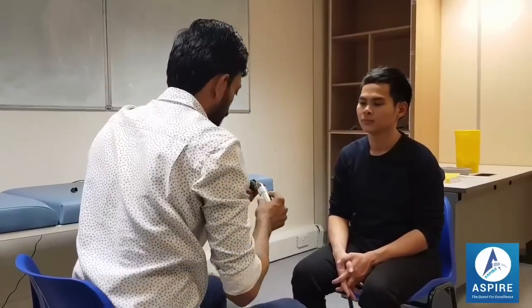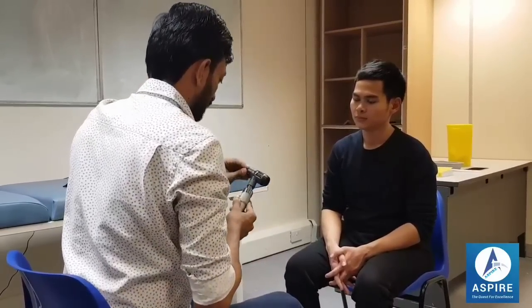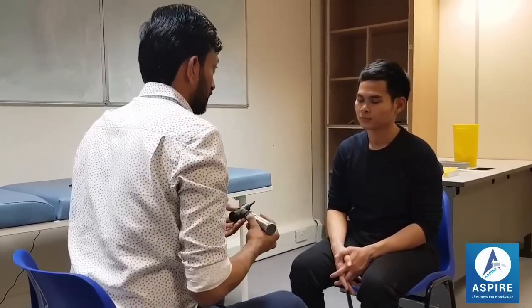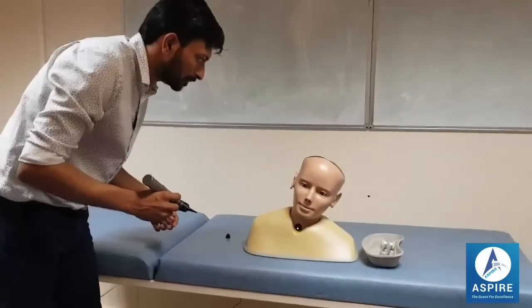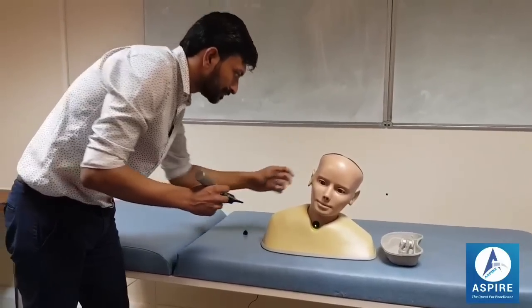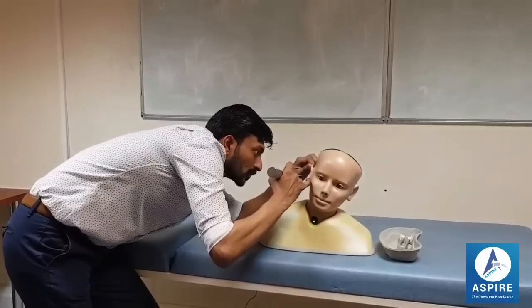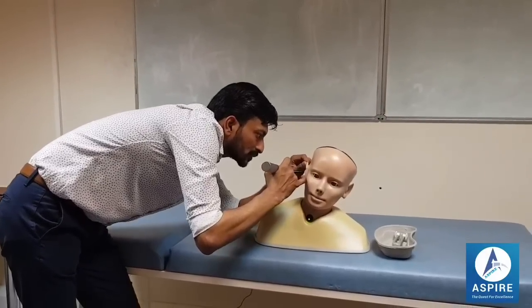Now I'll be examining your ear with the help of this instrument. If you have any problem or any pain, please let me know. There's no foreign body, there is no wax. Now I'll be inserting this instrument.